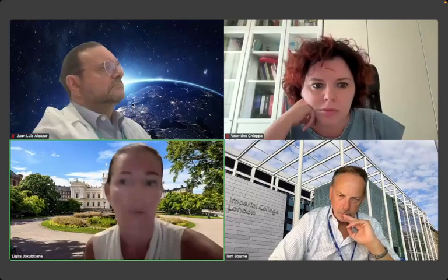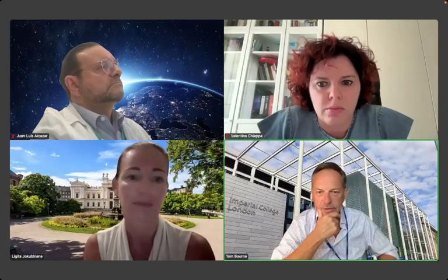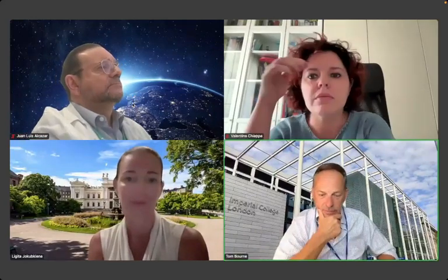So I think this is a very good tool, and more people would be able to use it because of that. It's very easy. It doesn't require a lot of experience. One of the things in ultrasound, obviously, is recognizing the pattern. So if something is identifying it for you, that learning curve is going to be so much faster, isn't it? I think it's underestimated how useful it is from an educational point of view, when you have effectively the distillation of an expert doing it through AI to show you. I think that is very helpful.